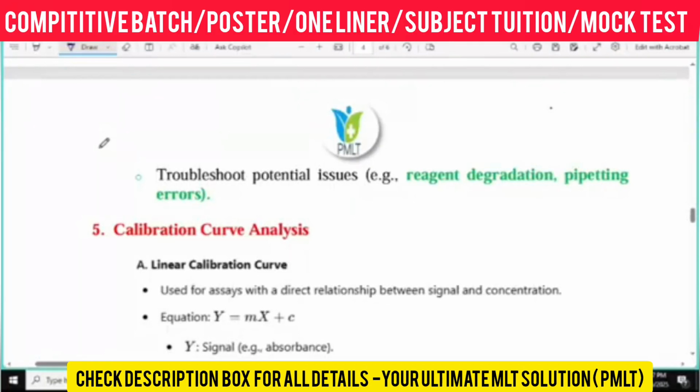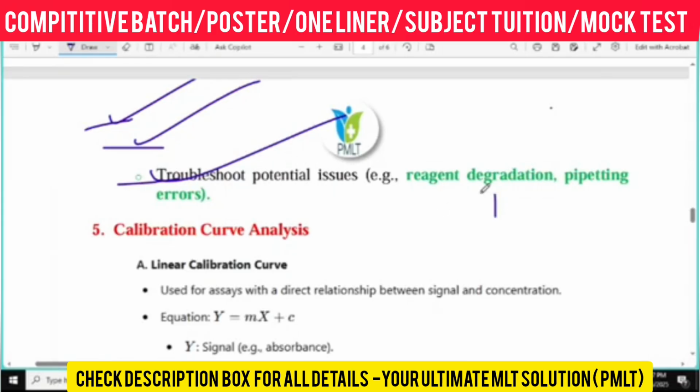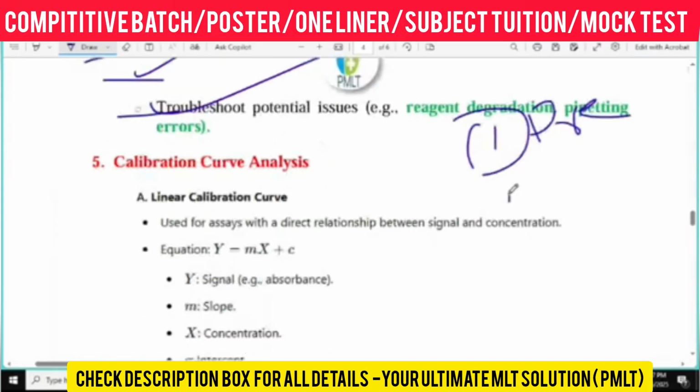Under instrumentation or signal measurement, there are three types: single, dual, and multi. Single point calibration, dual point calibration, and multi point calibration. Understood? After that, we have understood the process of calibration. Firstly, preparation, and secondly, running of the calibration.